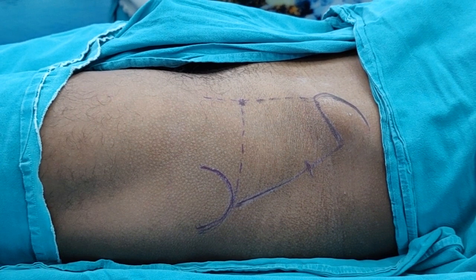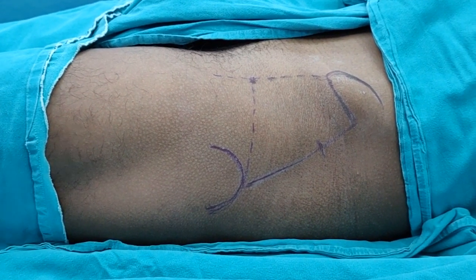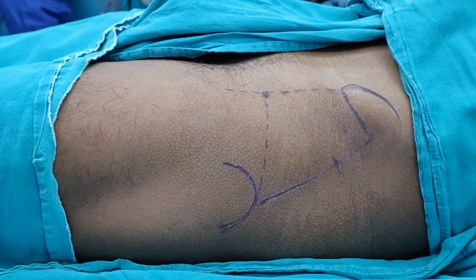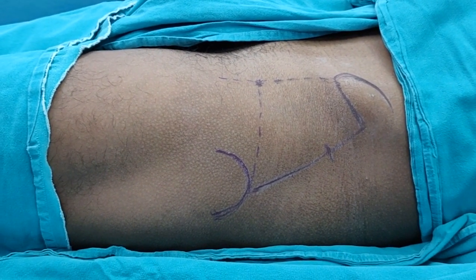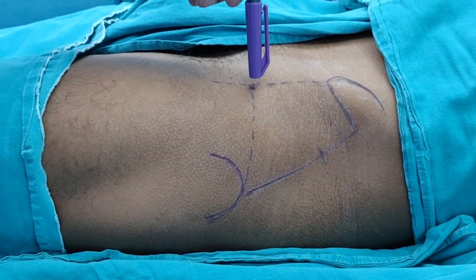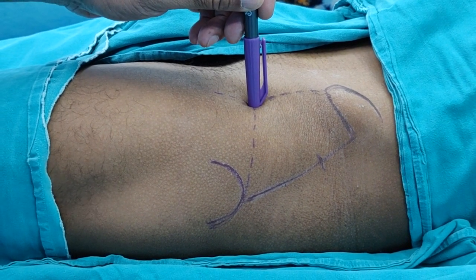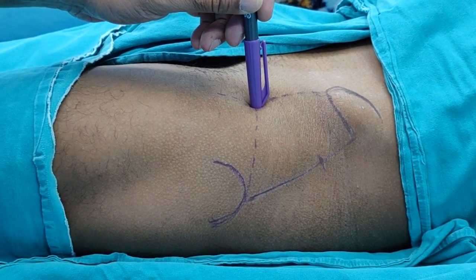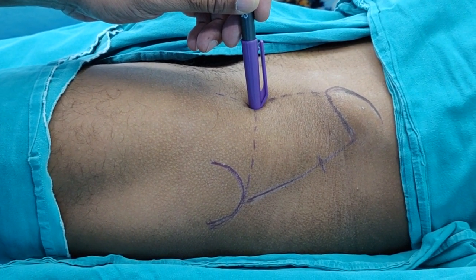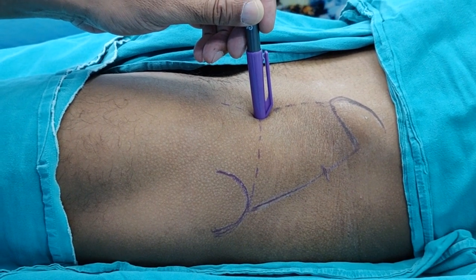Many authors have described different techniques. If you want to do this as an outpatient procedure without image guidance, you can directly go in from the front. The whole idea is to hit the femoral neck and be inside the capsule. Once you hit the neck, you can inject after withdrawing slightly.